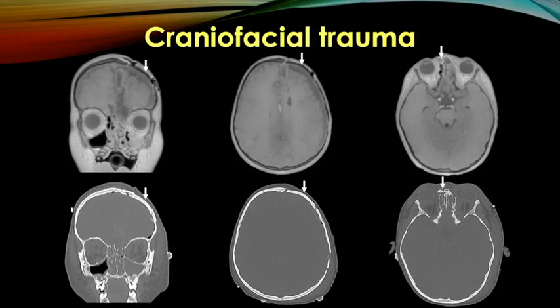Here's a patient with more complex craniofacial trauma who had multiple left calvarial fractures, as well as bilateral Le Fort 2 fractures. So again, with MRI, you're a little resolution limited in areas of really thin bone, particularly the paranasal sinuses, but we still get a really good assessment on follow-up of the defects in the anterior skull base, in the orbit, and also the hardware reconstruction of the calvarial fragments with minimal susceptibility.